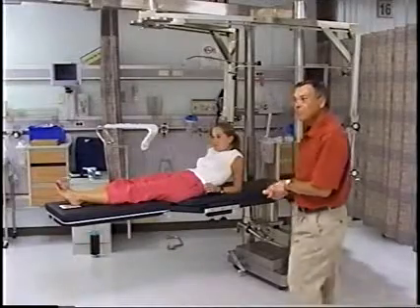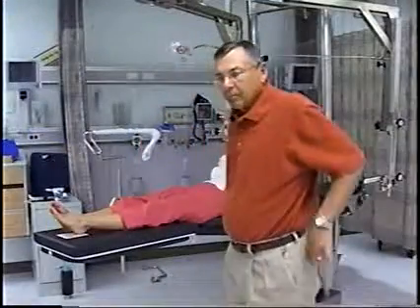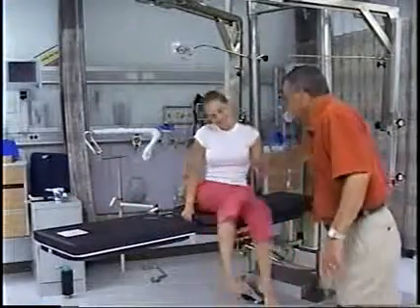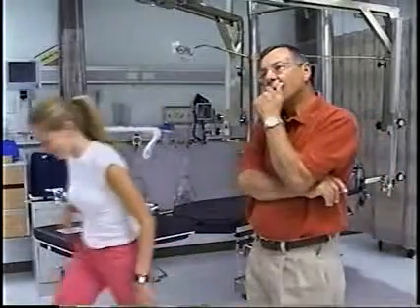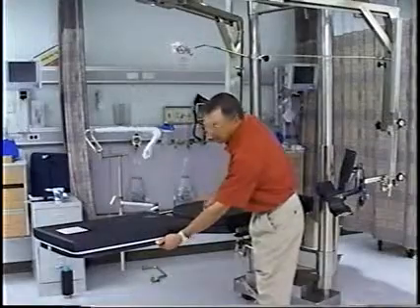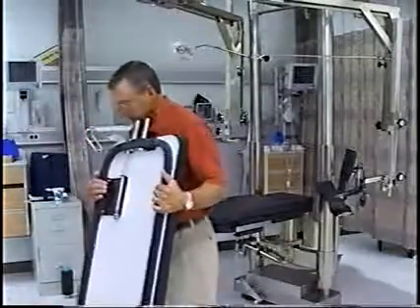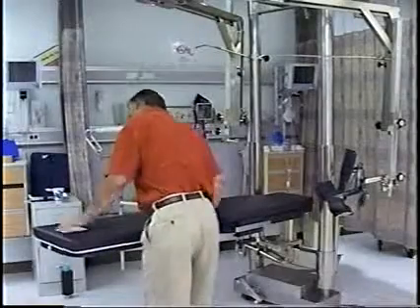Okay. We usually keep the stirrup all put together, the articulating pieces and the support, so that we don't have to do this. We don't have to do that. But anyway, I think a lot of people don't know that little handle, how to take that out. Yeah. There's a little squeeze handle only on the right side. And you simply squeeze it, and it comes off. Okay? And goes back in.